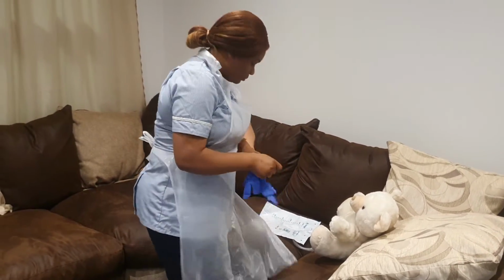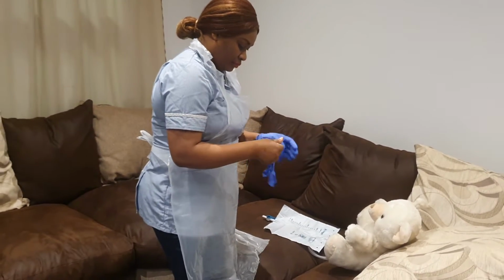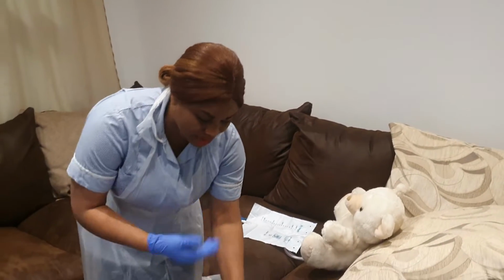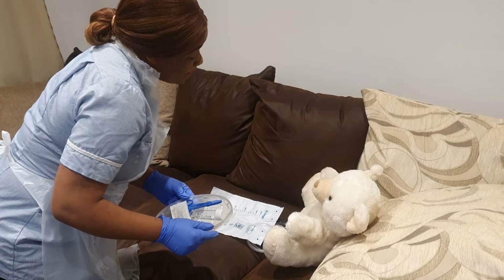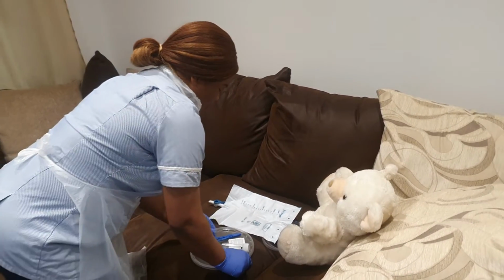All right. So I'm just going to make the catheter more prominent. I'm going back to my patient now. My son, please come closer. All right, I go over to my patient. Hello, Haley. Haley, I'm back. Are you still happy for us to continue? All right, lovely. Thank you so much.